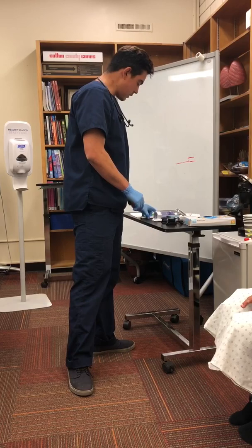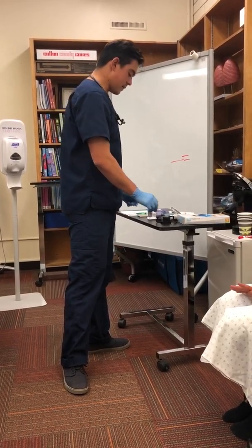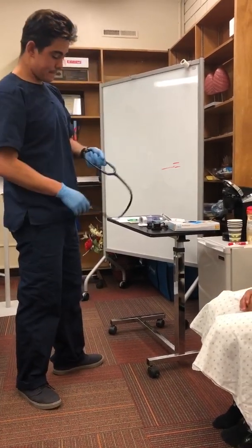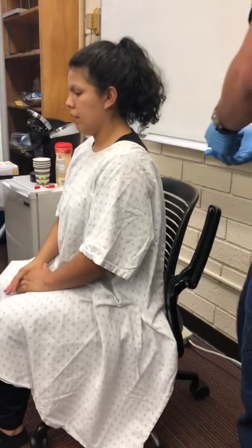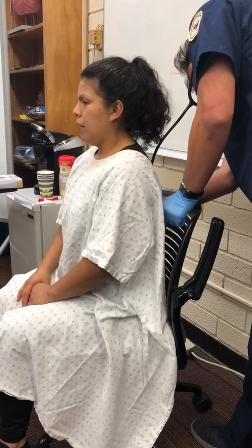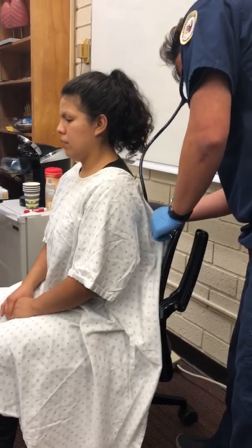So I've taken the saturation, pulse, and respiration rate. I'm going to go ahead and assess lung sounds, okay? I'm going to start at the back again. I'm going to do 4 on the back, 4 on the front, and then 2 on the sides, and 1 over your throat. Nice deep breath. Good. Good.